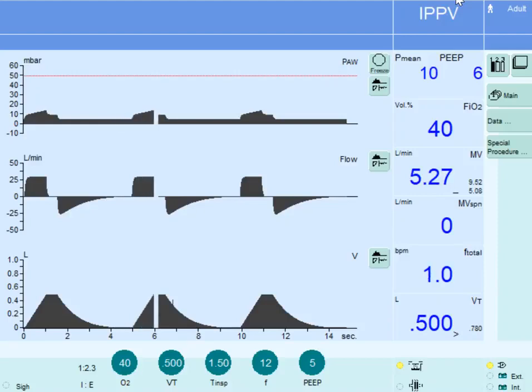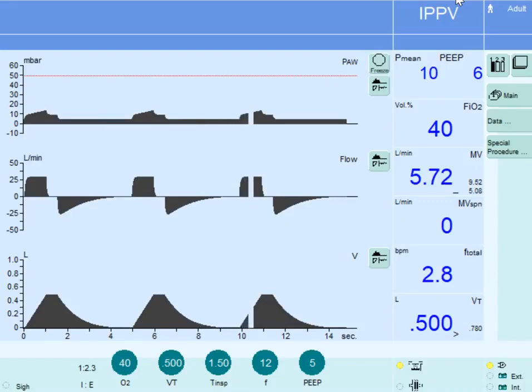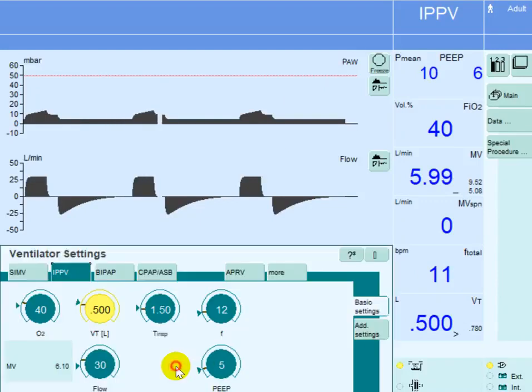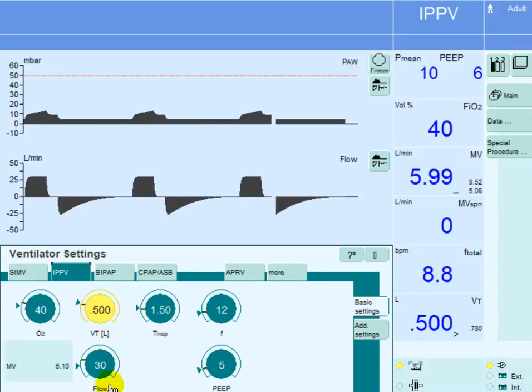In this video we will show how changing the flow rate will change the peak pressure and the plateau time. This patient is mechanically ventilated on volume-controlled mode of ventilation, and we are targeting a 500ml tidal volume, which will be delivered with a flow rate of 30 liters per minute.